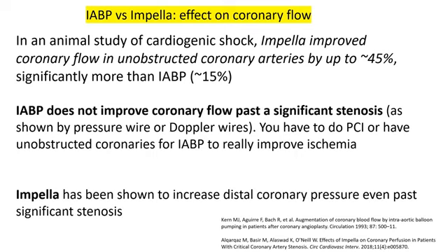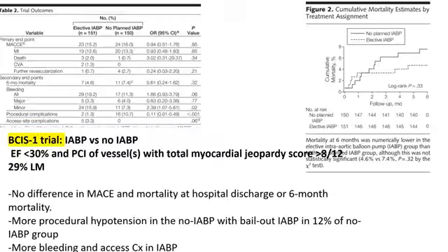This is actually how balloon pump is useful in supporting complex PCI. That's why we use balloon pump supported PCI. It helps the LV tolerate more ischemia during our balloon inflations and stent manipulation, and it allows a quick recovery of ischemia soon after you open the occlusion with your balloon. So faster recovery of ischemia, faster recovery of any potential hemodynamic compromise. So balloon pump support may be useful in complex PCI for those hypothetical reasons, as well as potentially this randomized trial.